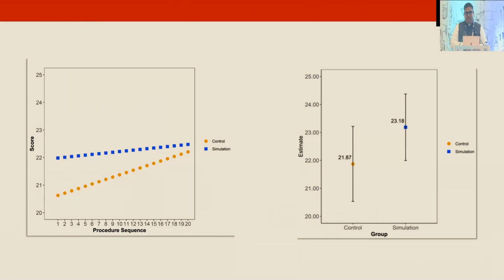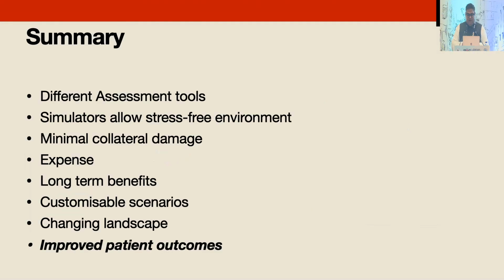is patient safety. So to summarize, we have different assessment tools to know how trainees are performing on a simulator and to see if the skill that they learn on the simulator translates to real life. Simulators allow trainees to be in a stress-free environment. Complications are no longer the trigger of stress that they used to be. There is no collateral damage to patients.